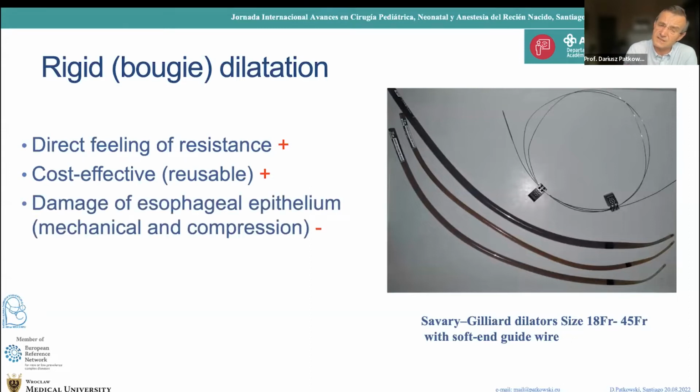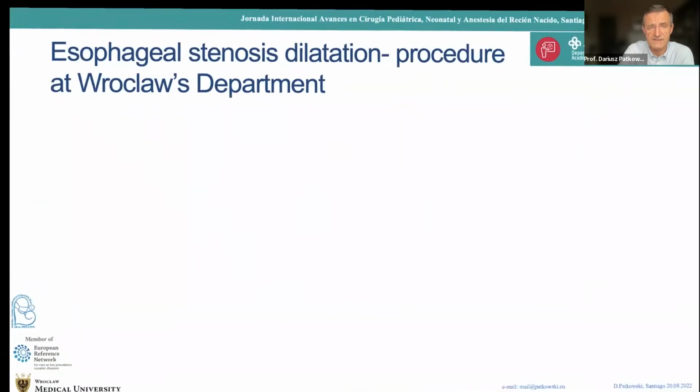The negative part of this procedure is that it causes mechanical injury to the tissue, by compression and mechanical tearing. So maybe it produces another scar.